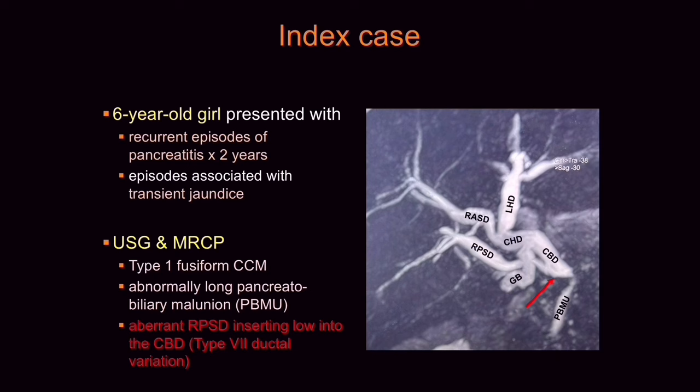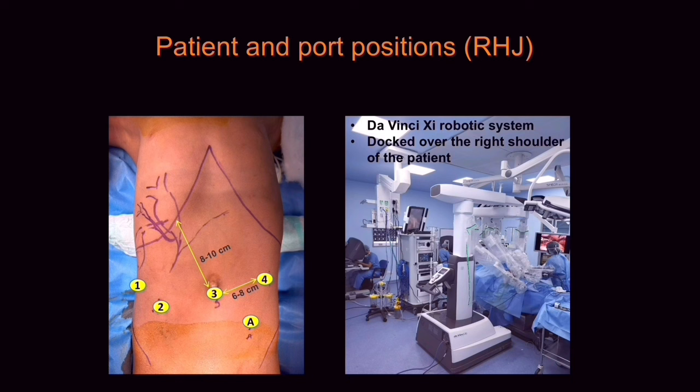These are the port positions for a robotic hepaticojejunostomy. We use 4 robotic ports and 1 assistant port. The robotic ports are placed in a straight line. The distance between the working ports should be 6 to 8 cm and the distance of the optical port from the target organ should be 8 to 10 cm.